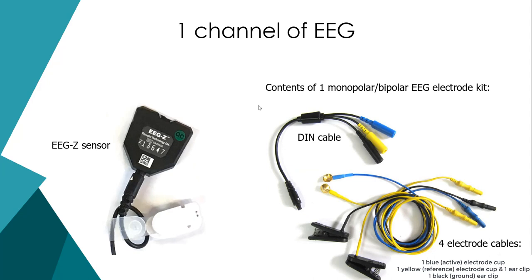Let me give you an introduction to the actual EEG sensor before I put it on myself. For this training example, we're going to focus on one channel of EEG, one sensor of EEG. I'm going to focus on a monopolar referential montage. I'm going to be using an EEG-Z sensor that links via a DIN cable and splits from one cable into three. Every single channel of EEG at minimum requires these three electrodes. Sometimes we share electrodes with other EEG sensors because we want the same ground or reference, but at minimum there are always three sites.